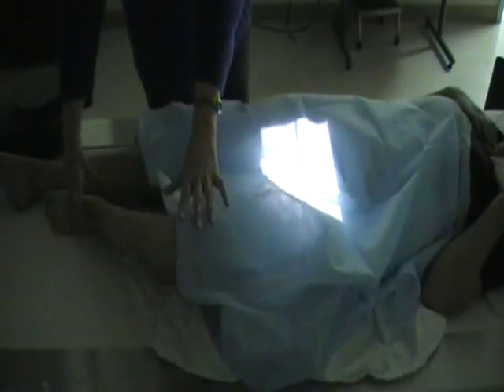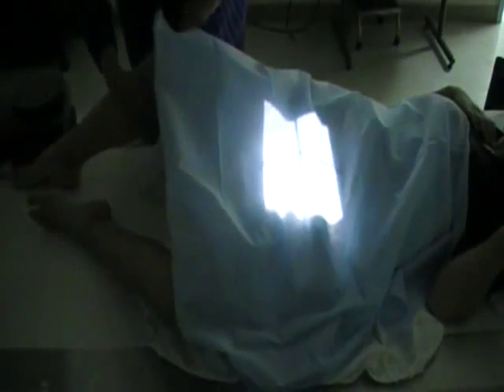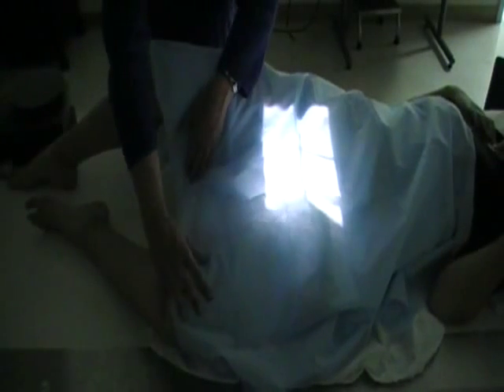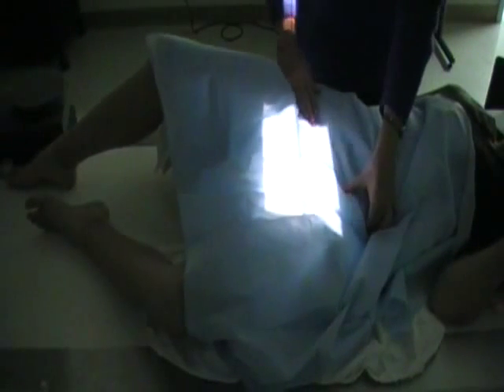The Lauenstein method is slightly different in that you lay the leg out all the way on its side. So it's easier when the patient bends the opposite leg to help accommodate that. And lay that leg all the way out on its side, and then you're going to have to again relocate your hip to make sure that you're still centered.